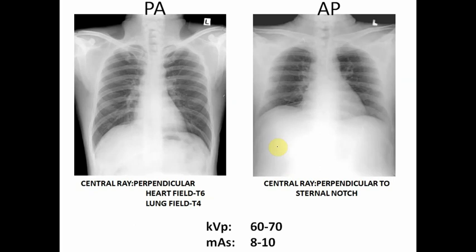You can see this is a comparison between two radiographs. Please ignore whatever content is written below. You can see how the image of the patient changes when you take the radiograph. Some examples I mentioned in the next slide, I'll explain.